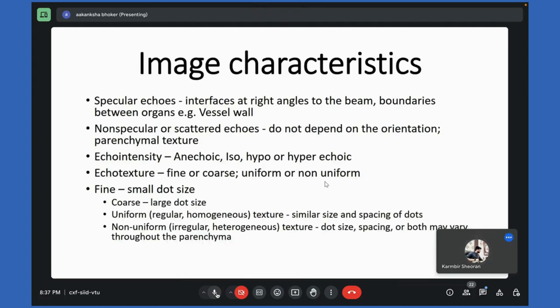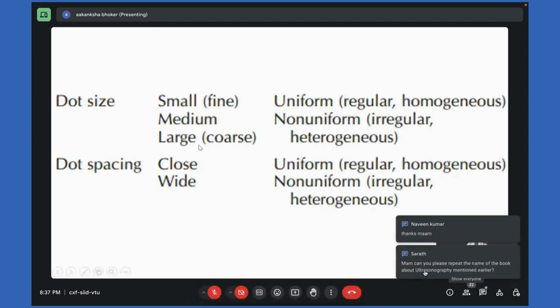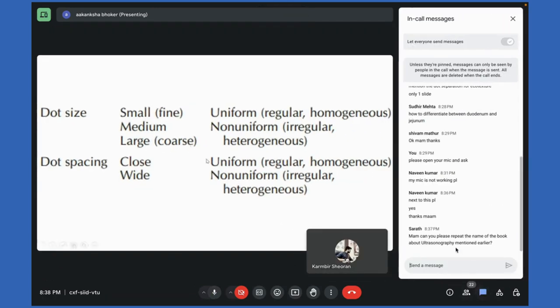Ma'am, next slide, please. Yes, sure. Based on size, the dots can be small, medium, and large. When small, it is known as fine. When large, it is known as coarse. For uniform, it is based on dot spacing. When they are very closely spaced, then it is uniform. When they are placed widely, then it is non-uniform. So uniform and non-uniform can happen based upon the size and the spacing, but based on size alone, it will be a fine ecotexture or a coarse ecotexture. Uniform or non-uniform is a combination of size as well as spacing. However, fine or coarse is a matter of size.